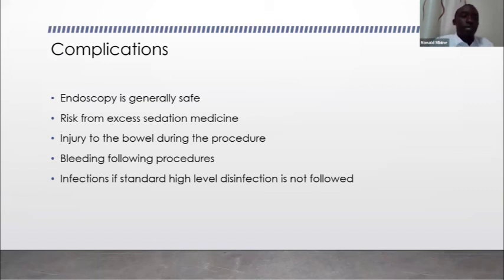This is where questions also tend to come, at least most of the times when I get questions. Complications. I always tell my patients that endoscopy is generally safer than the transport means they've used to come for the endoscopy. So you're probably more likely to die from a road accident than the endoscopy procedure. But nevertheless, there's always a risk, just like taking a flight, there's always a risk.